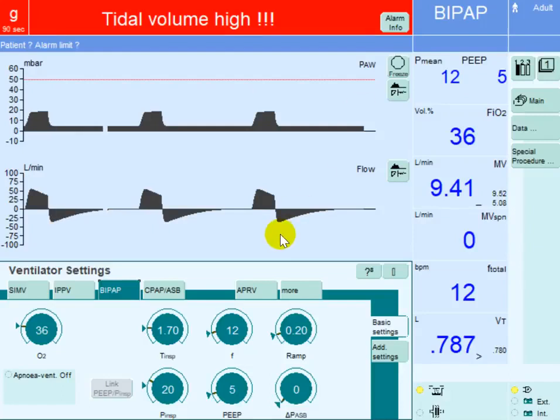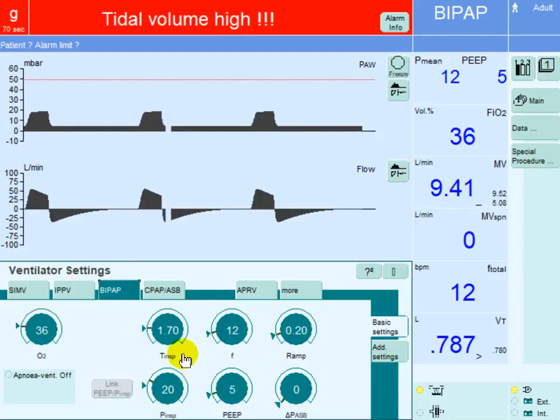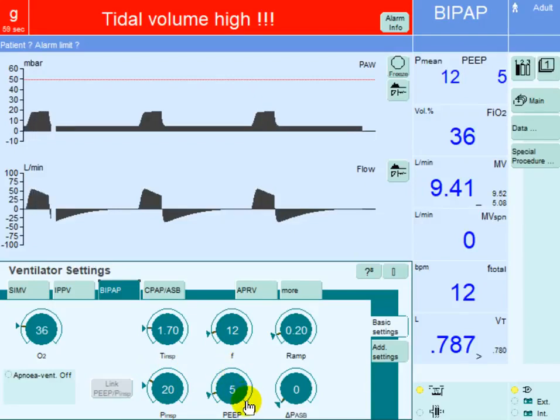In this video we will explain what rise time is. In some ventilators you will find it under the name of ramp. It is essentially a feature that can be changed in pressure control mode or pressure support mode of ventilation. In these settings, the inspiratory pressure is set at 20 and the PEEP is set at 5.